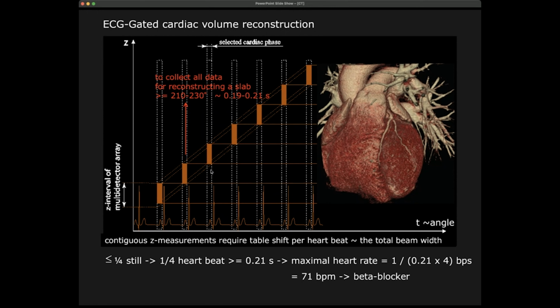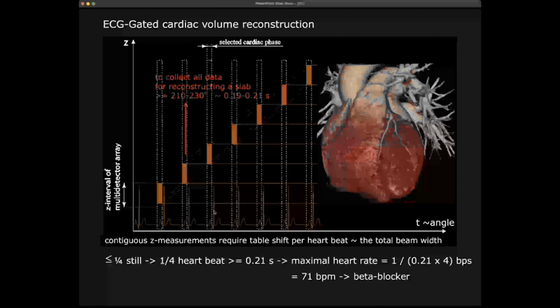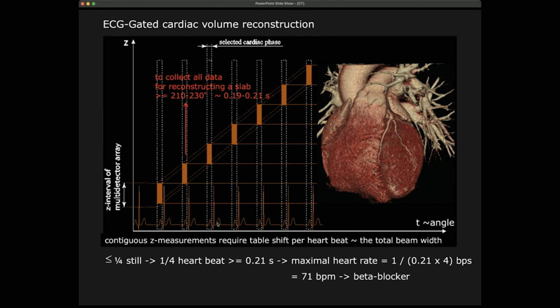Very typically, the ECG has the big peak, what we call the R wave. The R wave indicates the onset of contraction. So what we can do is use this peak in order to trigger. We measure that peak on the ECG, and then with regard to that peak in time, we can see where we either do the measurement or where a measurement was done.